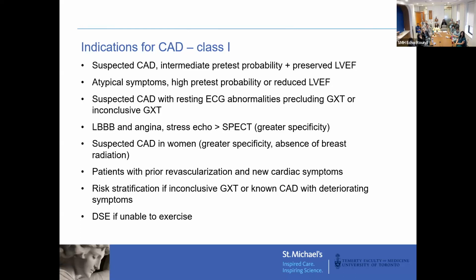And then just a caveat, there's also a classical indication that you can proceed to a dobutamine stress echo if the patient, for whatever reason, is unable to exercise. Then obviously you can use stress echo in that setting.